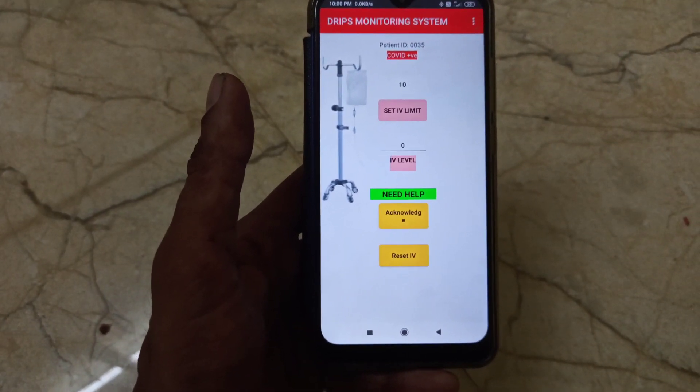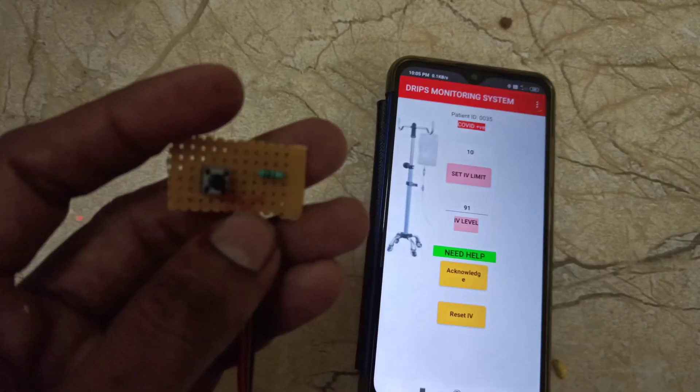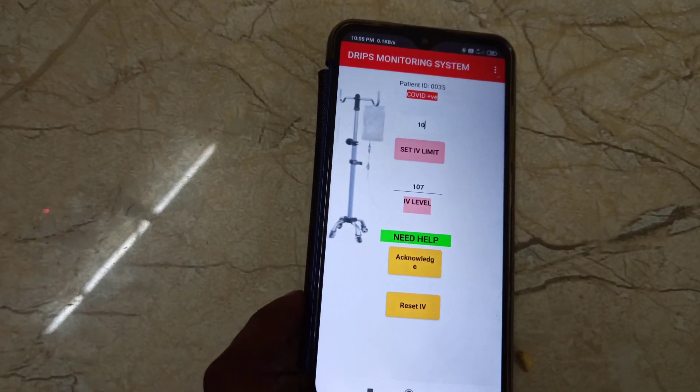The green color indicates the patient doesn't need any help. When the patient presses the help button from their bed, this green color becomes red. Now I am pressing the emergency button from the bed — this is the nurse's mobile.